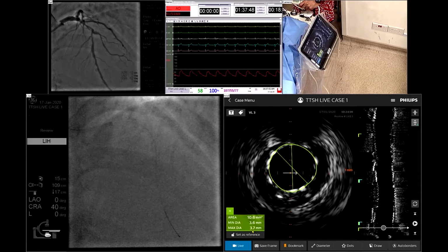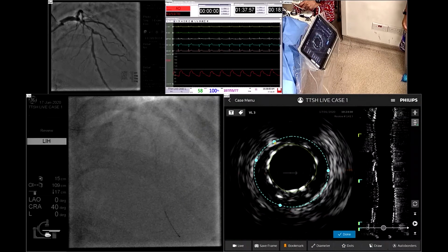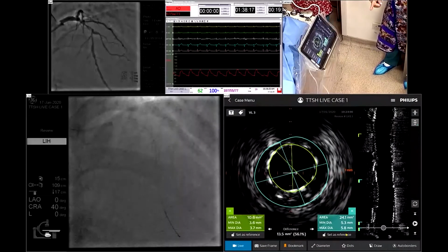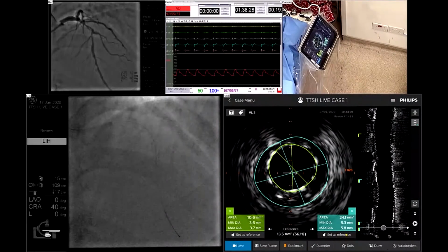Okay, measure the vessel. The vessel can go to 5.0, okay? Now, the stent probably can go to, on the stent expansion for the Osiro mission, the 3.0 stent can go to 3.5. So I'm keen to hear what the panelists have to say. Do you want me to go higher with a 4.0, or do you want me to leave it as that? I'm open to suggestions. Okay, maybe we can start with Jiang. But while you're thinking, can we look for a 4.0 NC?